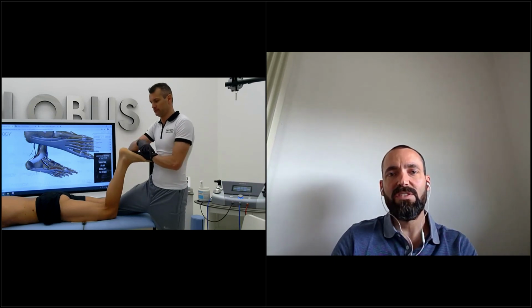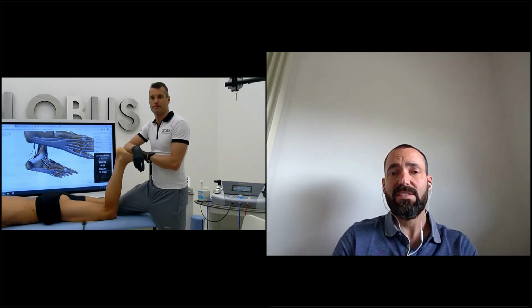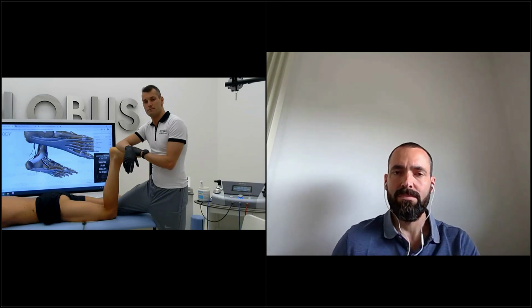So always start treatment there. Even when I treat a plantar fasciitis, I start in this position with hard and deep treatment for soleus, and then change position for the Achilles tendon, or for plantar fasciitis, but always start concentrated with focus on the calf, especially soleus.